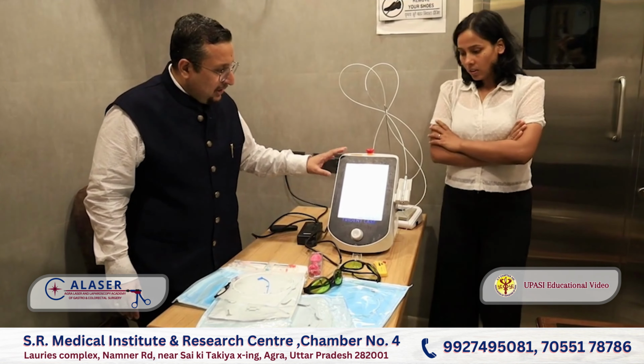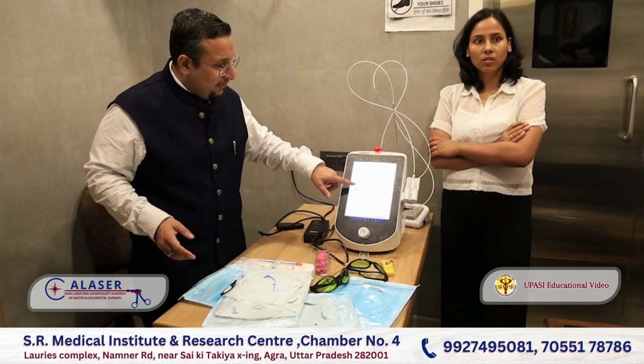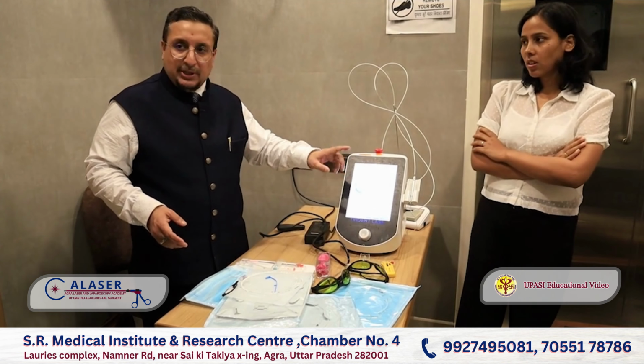This is your laser machine. What we have to see here, you have to understand the things. Right? First, we have to see this is the power of the machine. In the further lectures, I will be telling you which surgery is to be done at which watt. So this is the wattage: 6 watt, 8 watt, 10 watt, 15 watt.